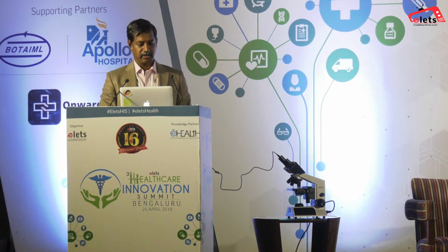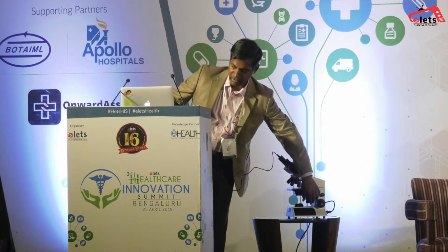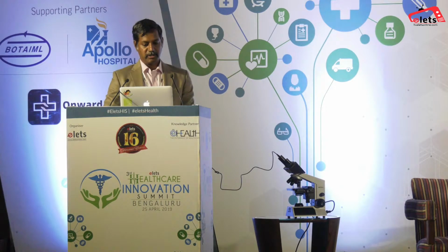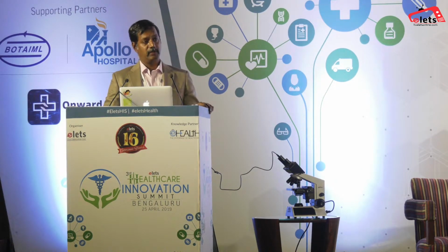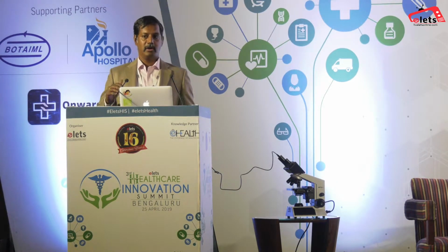So in this case, I can just say snap photo. I can pan the slide, right? I can pan it to a different location and click photos again, and then I say done, right? So this is primarily what the technician is doing at the remote end, and it's running out of a mobile hotspot. The technology is built to primarily work in low resource settings.